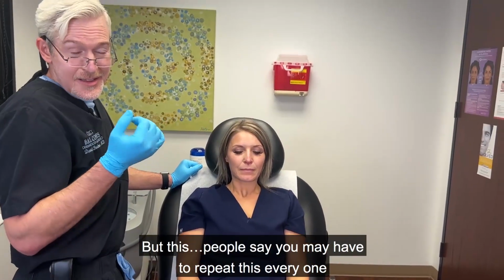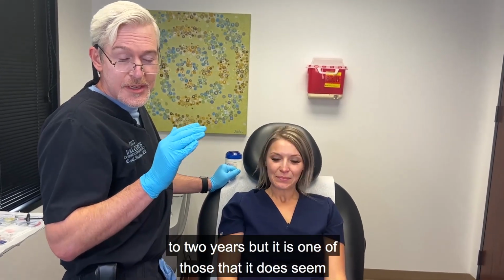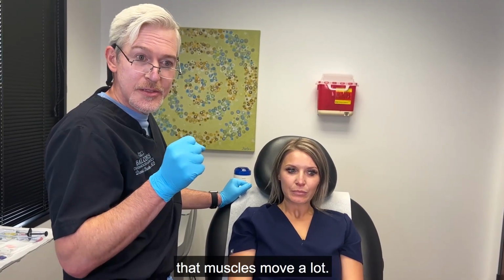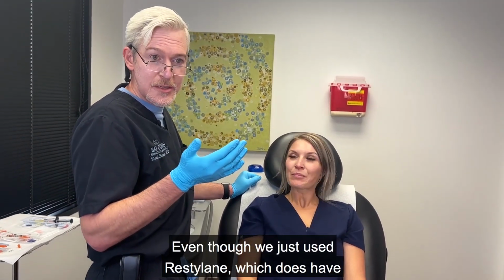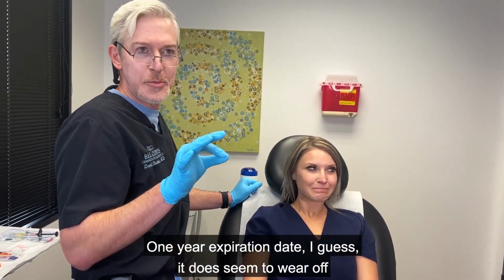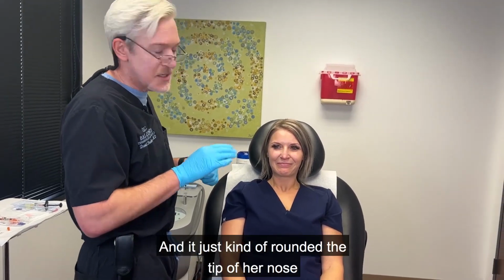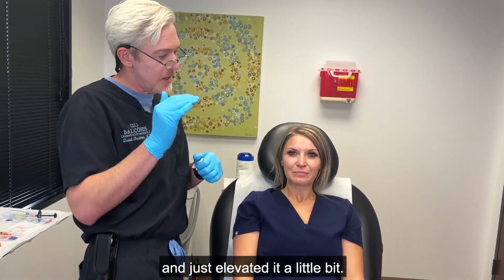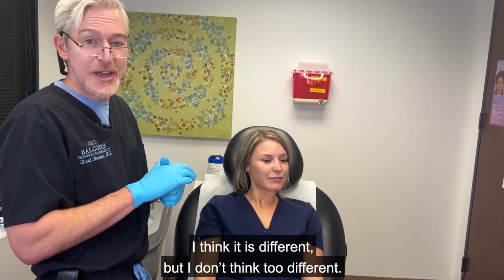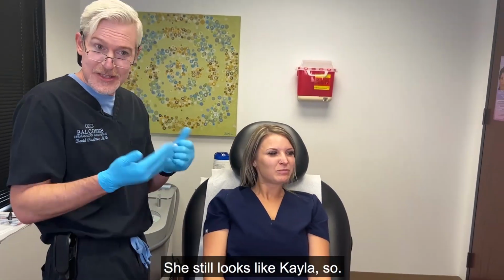People say you may have to repeat this every 1 to 2 years, but it does seem to last for a pretty long time, because it's not in a place that muscles move a lot. So even though we just used Restylane, which has like a 1-year expiration date, I guess, it does seem to wear off in a year, but this should last a good long time. And it just kind of rounded the tip of her nose and elevated it a little bit. I think it looks very normal and natural. I think it is different, but I don't think too different. She still looks like Kayla.